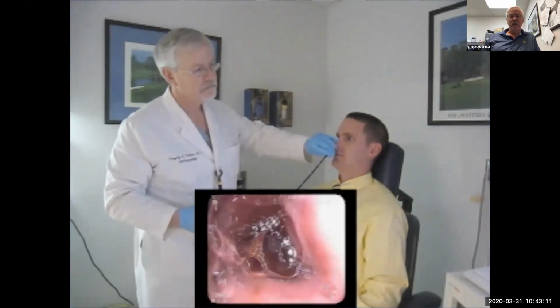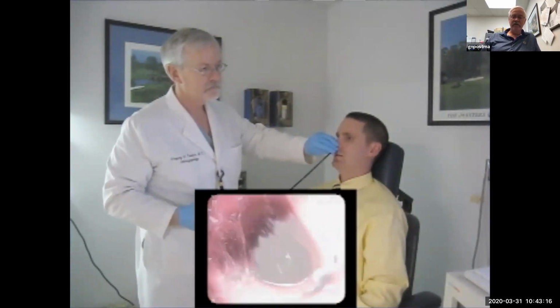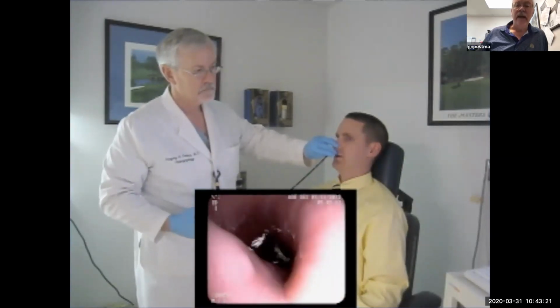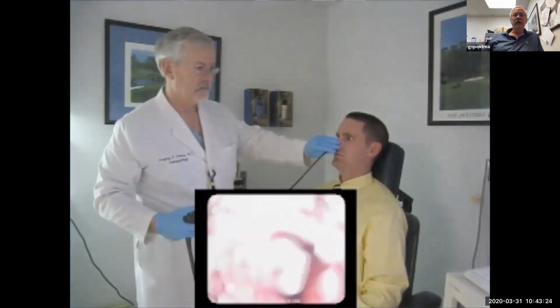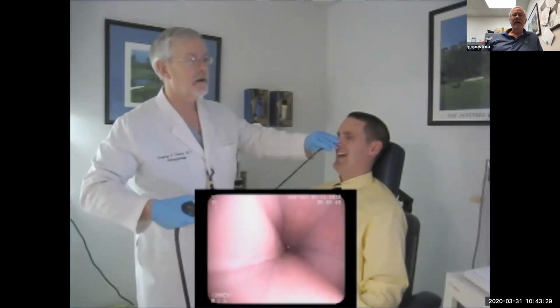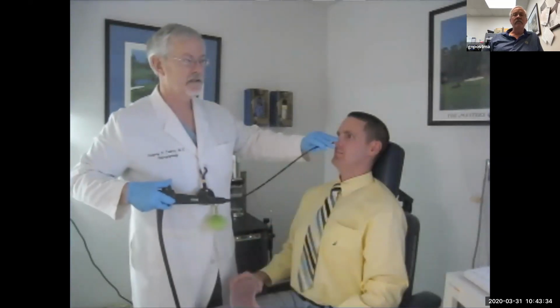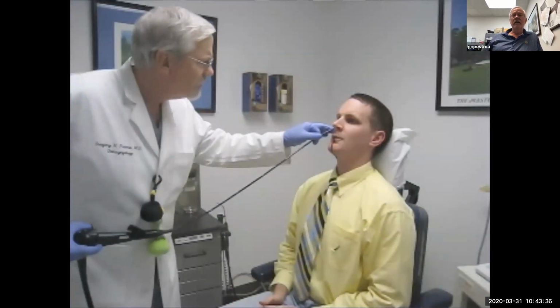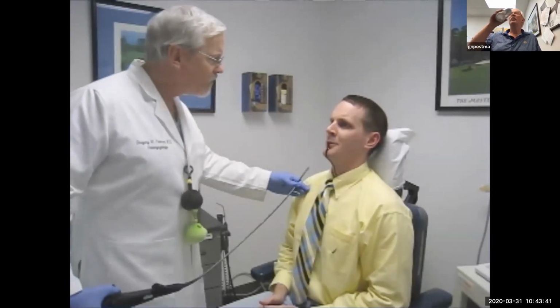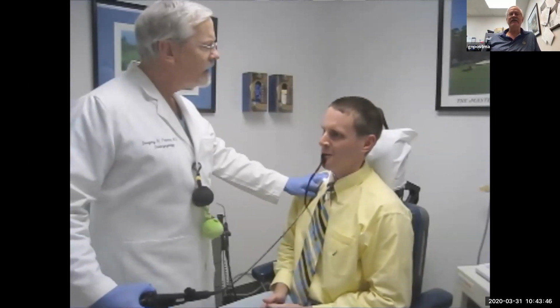We talked about complications earlier. People are always worried about things happening, but complications are remarkably uncommon. And you'll get an occasional vasovagal episode, very rare, and occasional epistaxis, but it's usually fairly minor epistaxis that can be dealt with by just pressure on the nose. Sometimes epistaxis is a little bit worse.